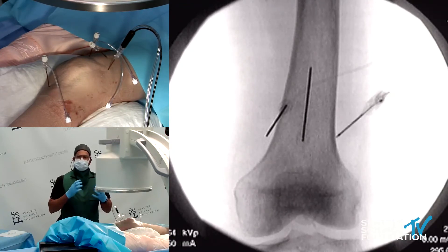You can also target very specific parts of the knee. So if the patient only has medial pain, you don't have to do all four needles — you can really focus on those two medial needles. With the 2020 coding and reimbursement, there is one CPT code, 64624, for the knee. It doesn't matter how many needles you put in, as long as you're doing the job correctly. You can also do this with ultrasound — certainly something I was doing back at UCSF. But with fluoro it's so quick and easy. If you have ultrasound skills or a patient is pregnant, then by all means use ultrasound.